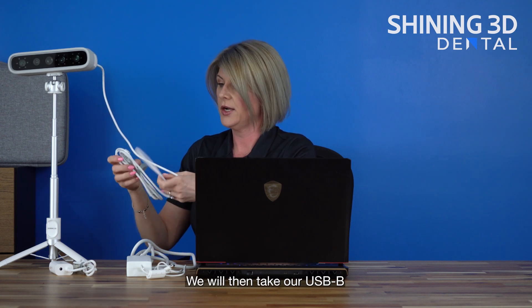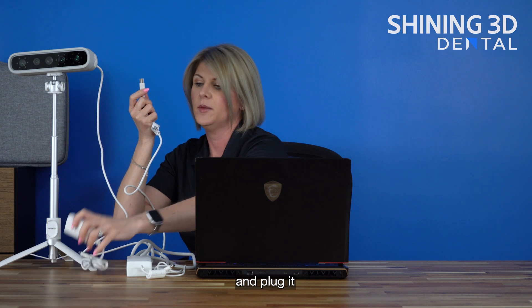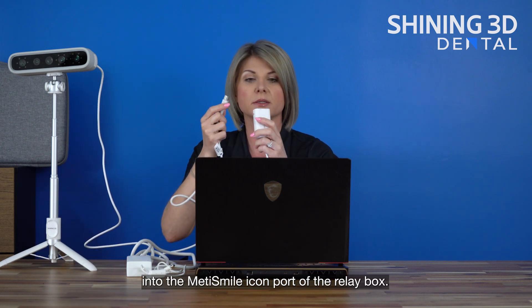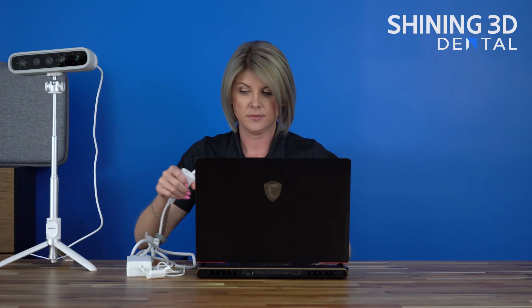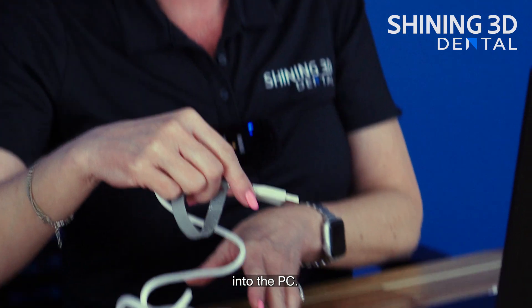We will then take our USB-B and plug it into the MetiSmile icon port of the relay box. We will then attach the USB into the PC.